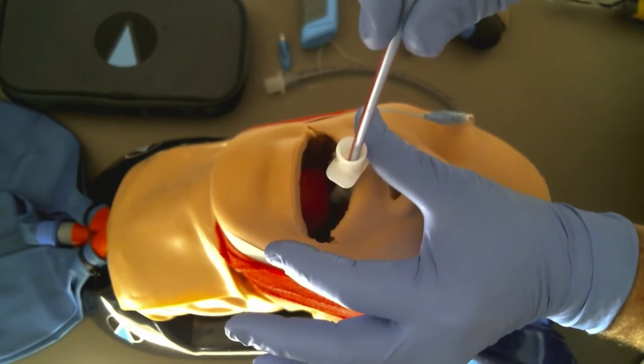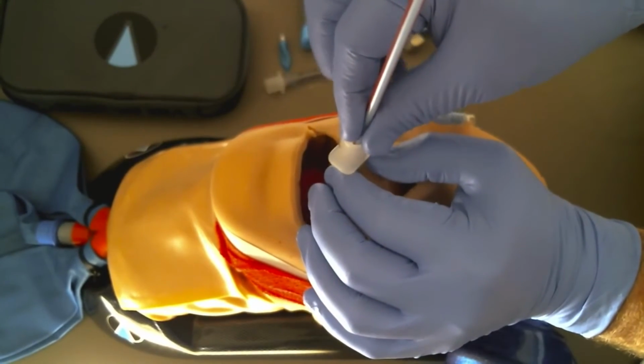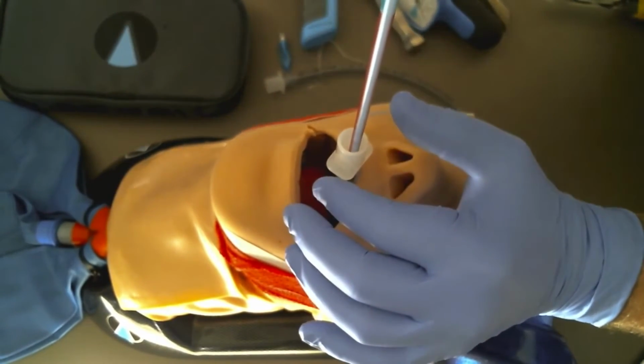Now I'm going to show you from the inside what this might look like. Now with the endoscope down the barrel of the V-scope, let's take another look from the inside. So I'm going in midline, purposely going a little too deep. And that's what we're seeing. I'm looking directly down the barrel, and even with the camera in there, I can have plenty of room. I don't see anything, so I just back up a little bit with the barrel.